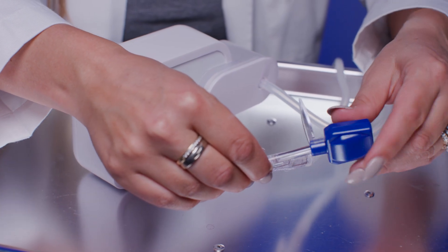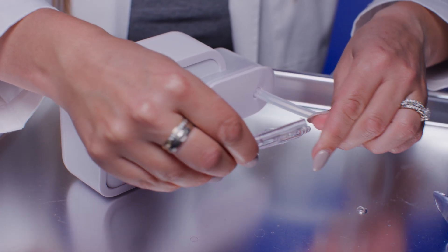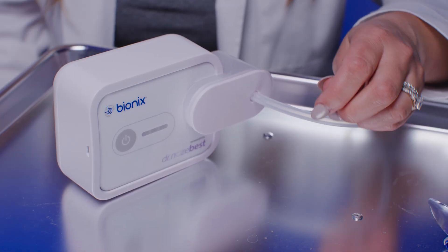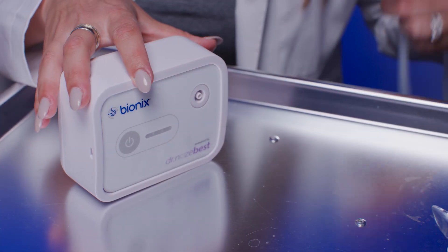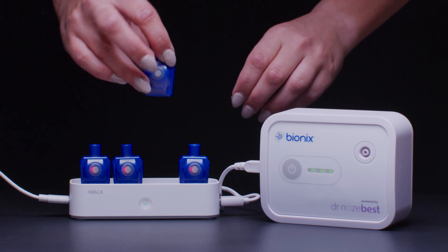After use, turn off the pump. Dispose of the single-use handle. Clean the rechargeable light source, magnification lens, cerumen catcher, and suction pump exterior. Charge the suction pump and light source as needed.